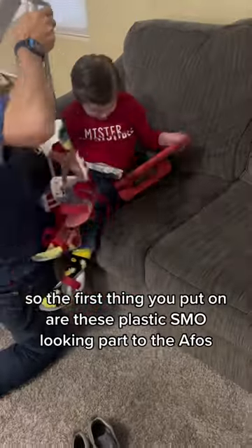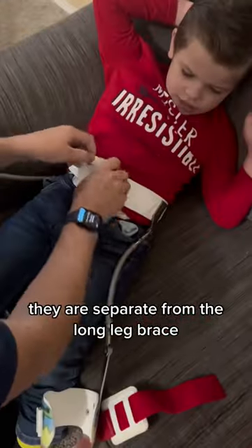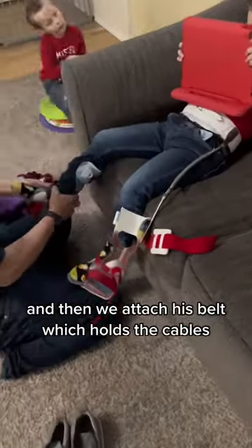So the first thing you put on are these plastic SMO-looking parts of the AFOs. They are separate from the long leg brace. And then we attach his belt, which holds the cables.